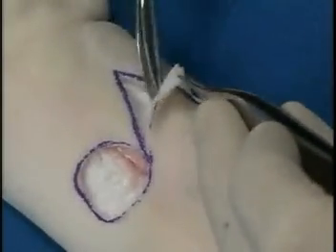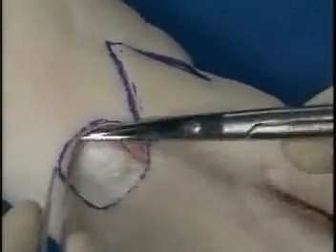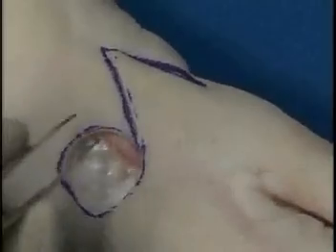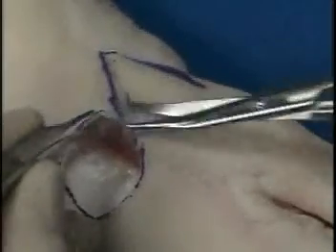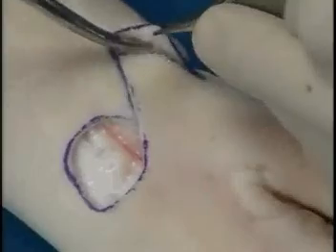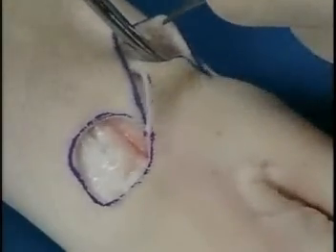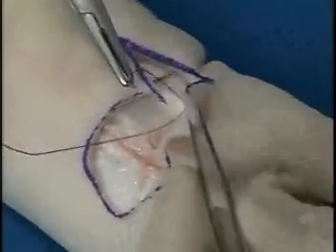Now the dissection begins at the apex, at the 60-degree angle apex, and it is widely undermined so that the flap can be rotated into the circular defect to close that circular defect. We will have some excess tissue at the apex of the flap that needs to be trimmed.